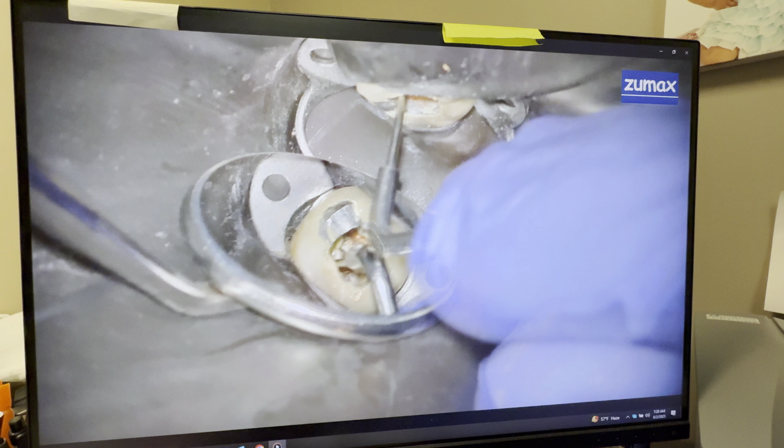That's the missed distal buccal canal. And as you can see, he didn't mess with that one, and the file goes in pretty smoothly. This is the lingual canal. There was a little bit of gutta percha in there, like a single cone, that we were able to dissolve in chloroform and go through. And now I'm regaining patency in the distal lingual canal.